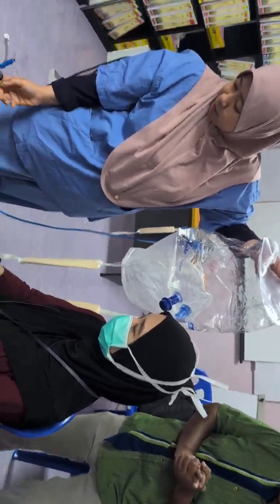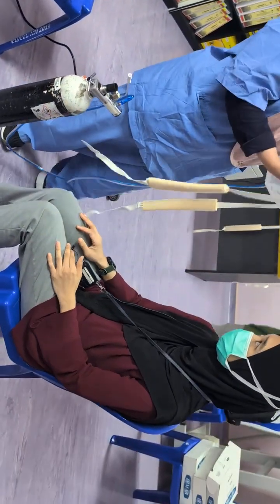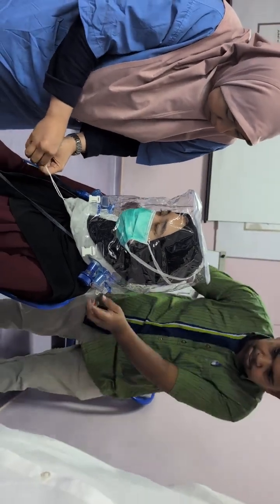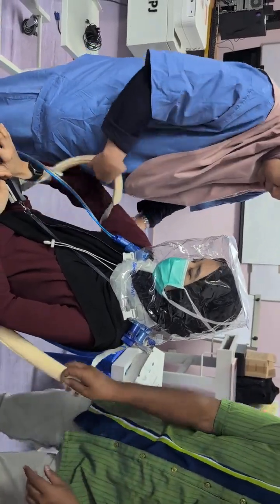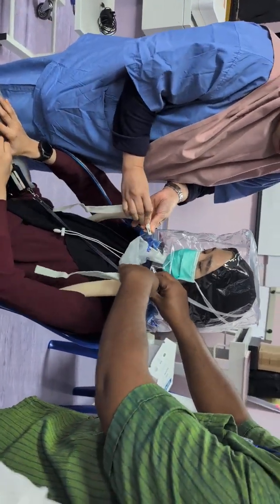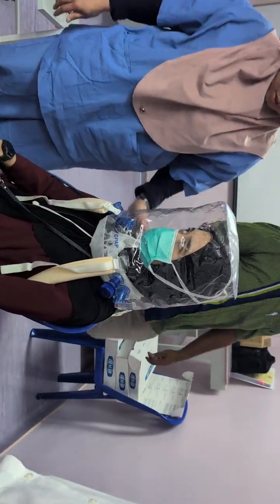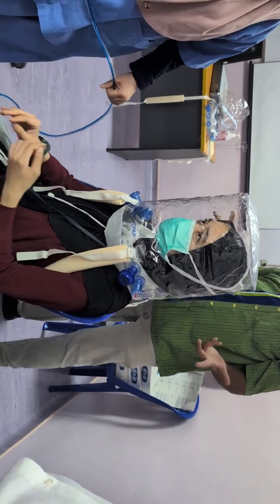Saya buka dulu. Perfect. It's not inflating. Okay, we need to strap it first. Until it's done, okay? Now, you see, this is not inflating, so there is a major leak somewhere.